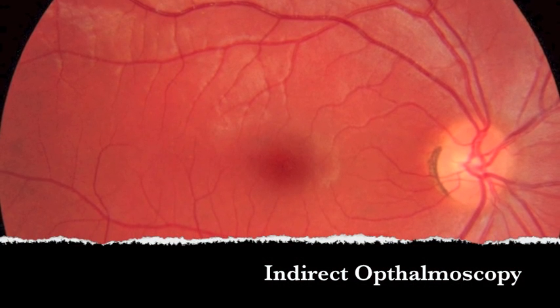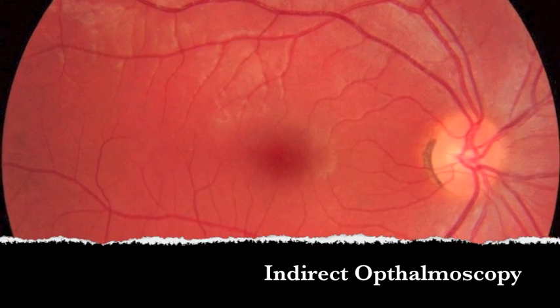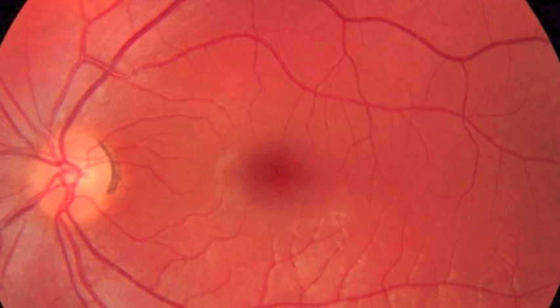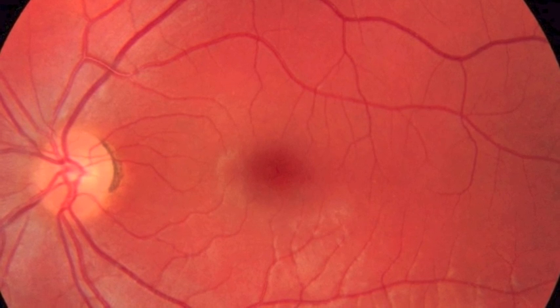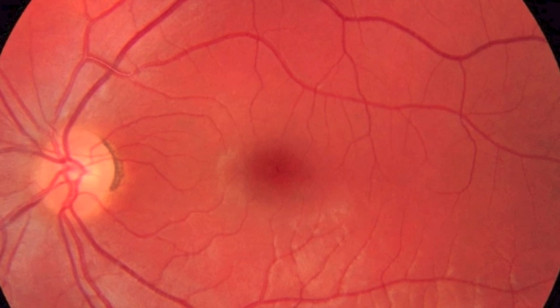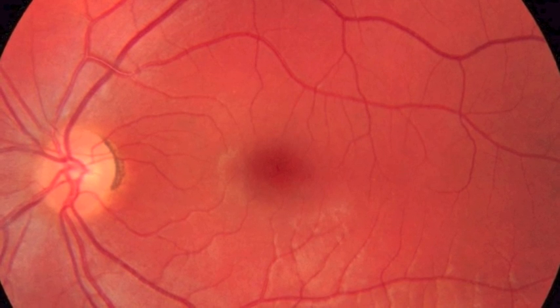This video is about indirect ophthalmoscopy. This produces an inverted, laterally reversed real image of the fundus. Compared to direct ophthalmoscopy, the image we see is lower magnification, but the field of view is much greater. We can also see much more of the peripheral retina.